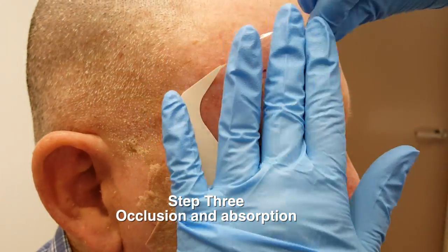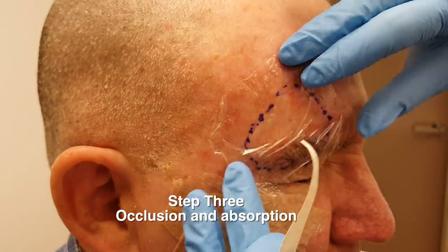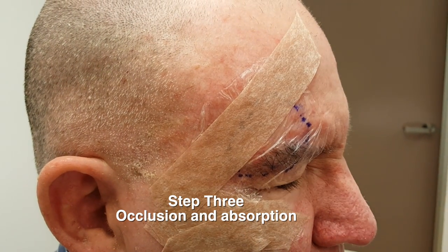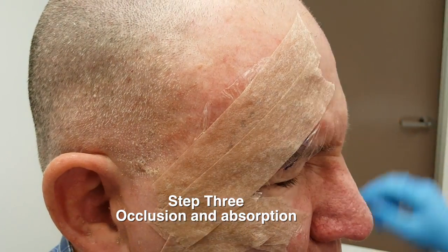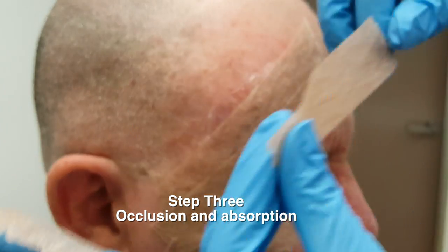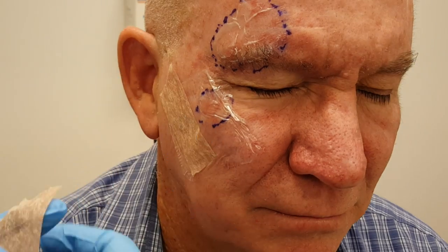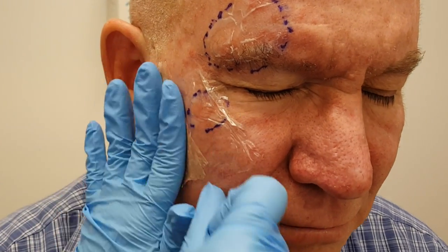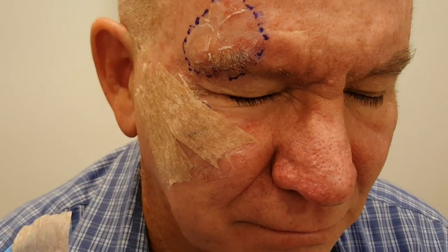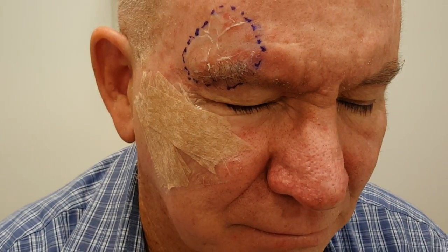Step 3 is occlusion. The cream needs to be absorbed, so we cover it up with tape — brown tape — so light doesn't go through and prematurely activate the chemical. We tape up both sides. The incubation period means the cream gets left on for a period of 1 hour all the way up to 3 hours.